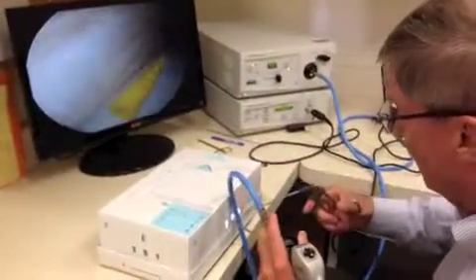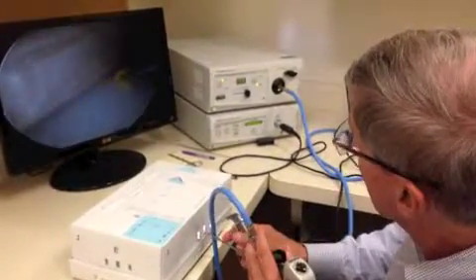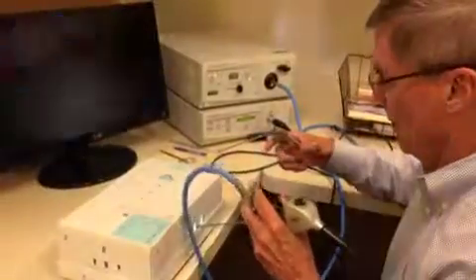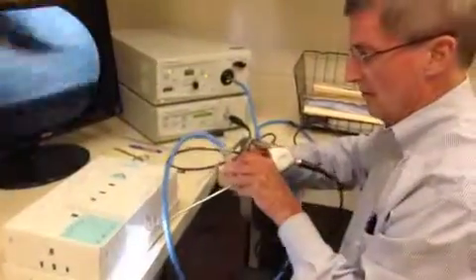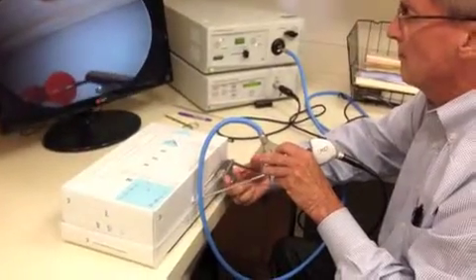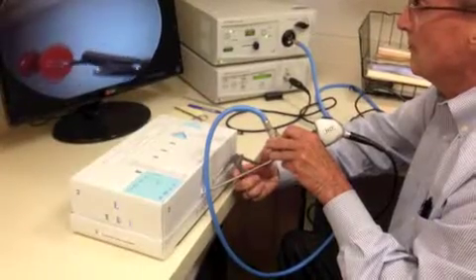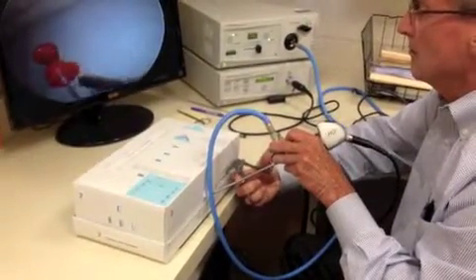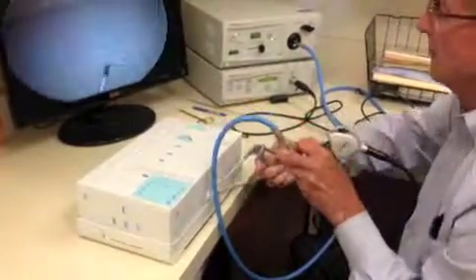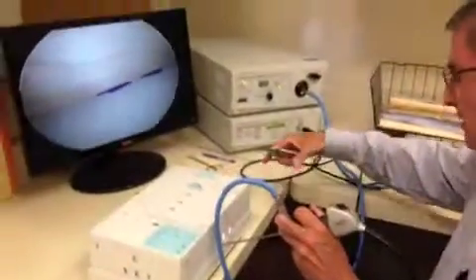We remove each of the ten loose bodies one by one using the grasping instrument. That's task number three.